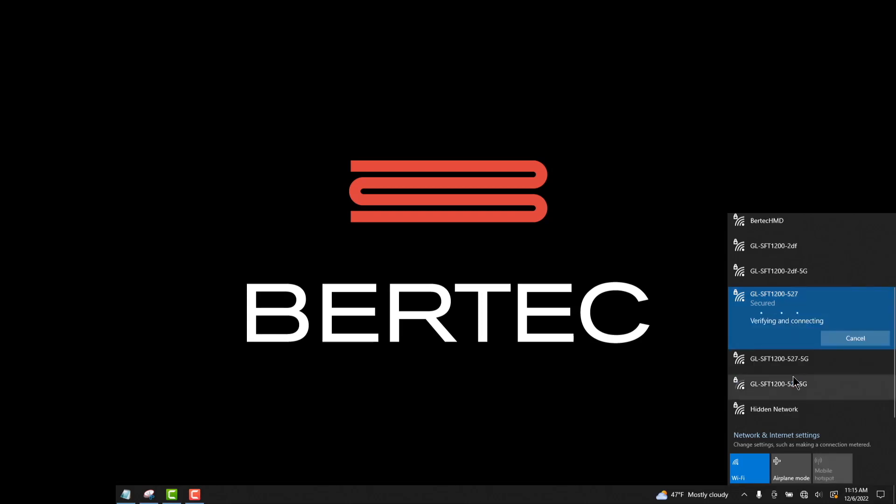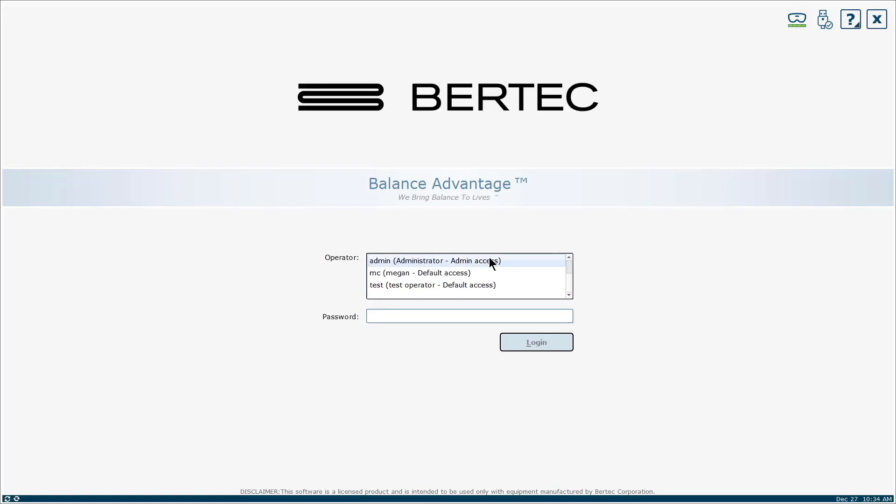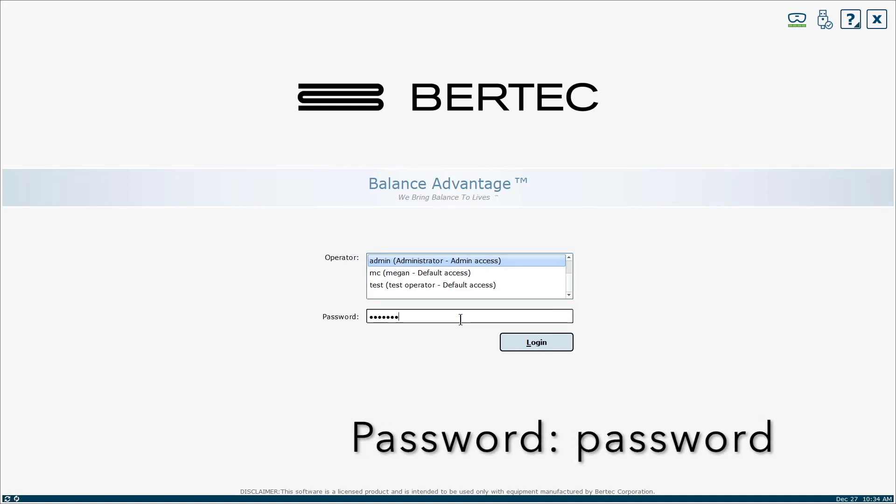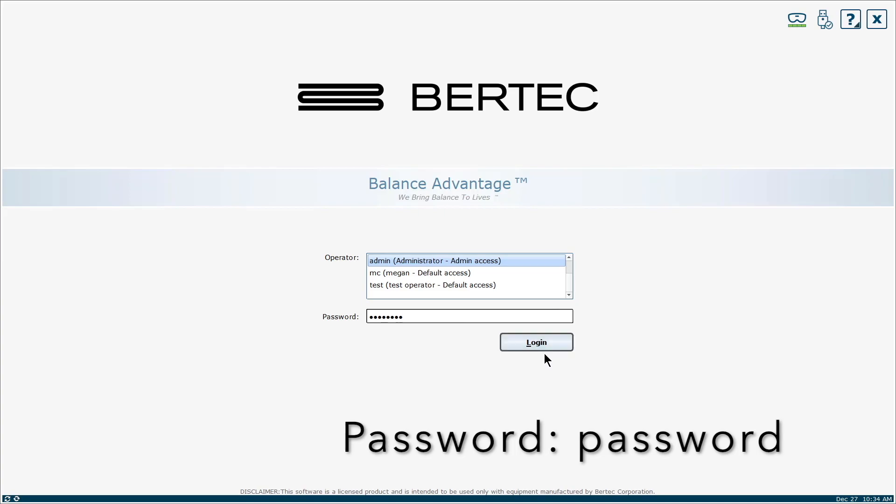It will then take a second to connect, but once you are done, you can log in to Balance Advantage. Log in to Balance Advantage with your system's credentials. The default login is Administrator and the password is Password in all lowercase.